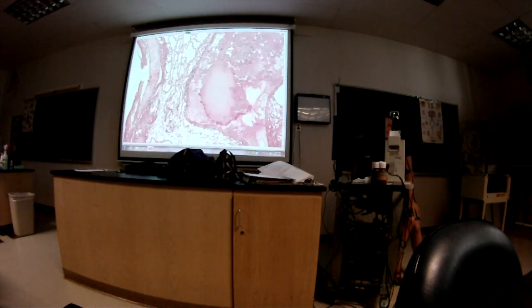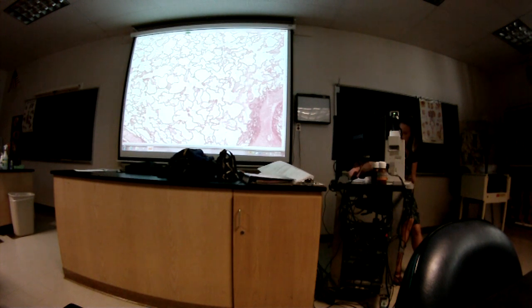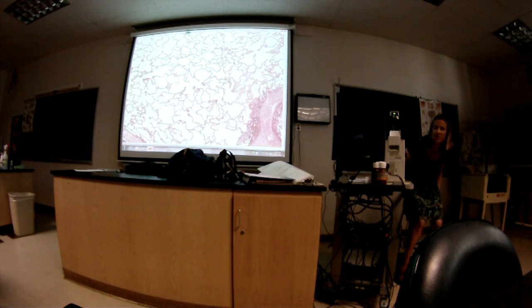Question 12 was, what kind of tissue lines this structure? Simple squamous. That one? What is that? You didn't take endothelium? That's an alveolus. No, I won't take endothelium. Endothelium is not a tissue type.